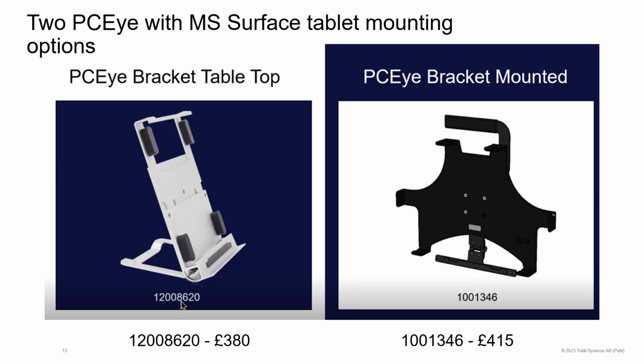This is the product number 1001346, which is perfect for mounting onto a floor stand or a wheelchair mount.